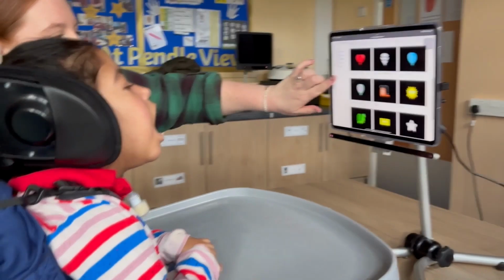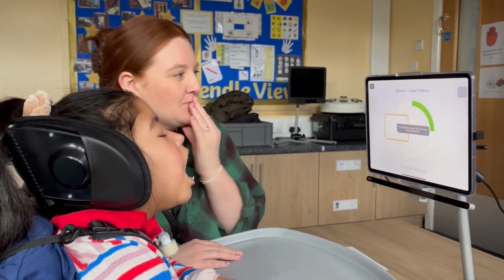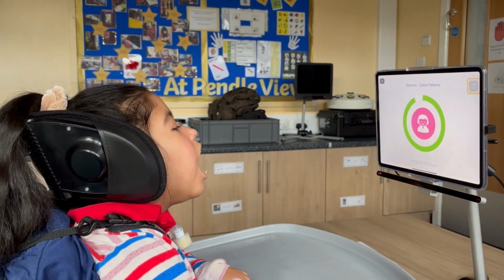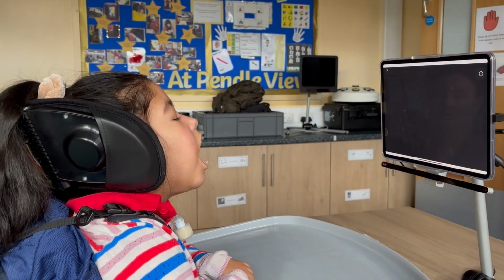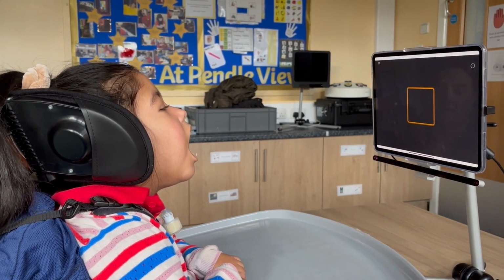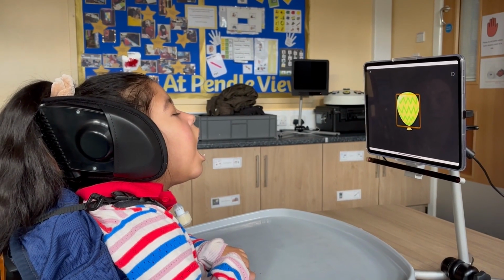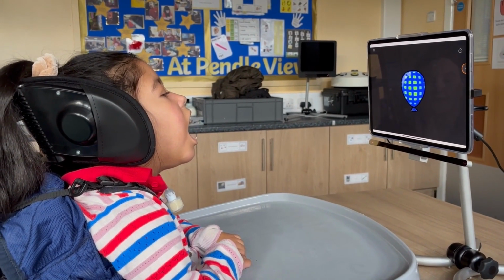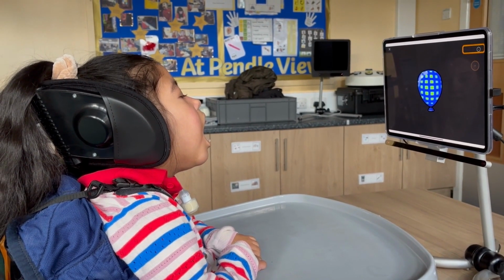Should we do one more and then we'll make it a little bit trickier? Oh, you've picked one yourself. Wow. Clever girl. Now, for those of you interested in Insight, as I said, it's available on helpkidslearn.com, and you can register for a free 2-week trial. Just go into Help Kids Learn and click the sign up now button for that.